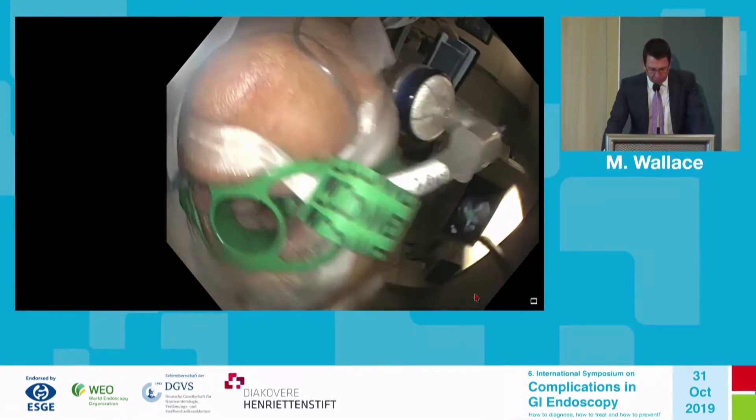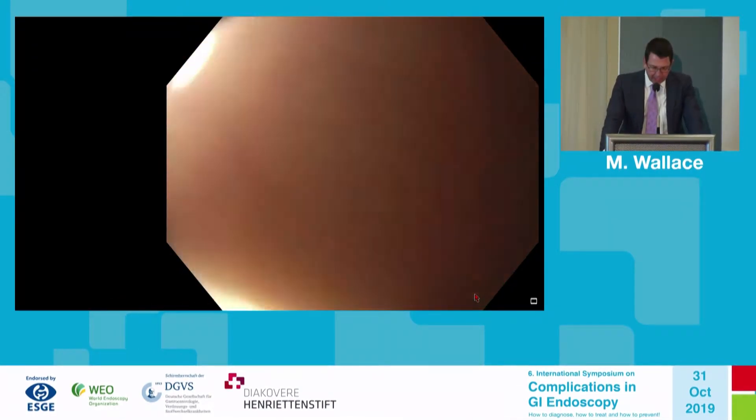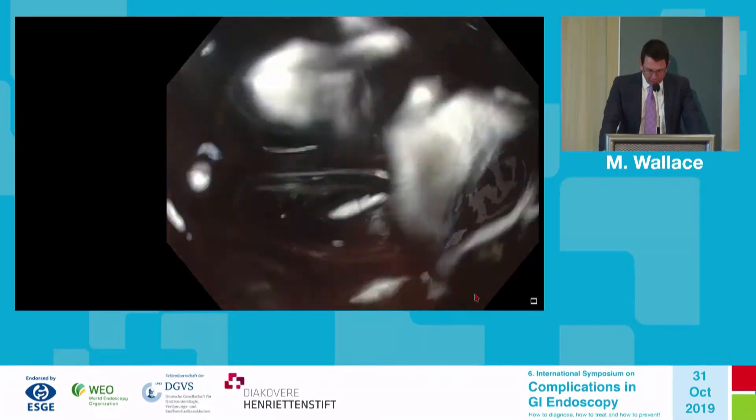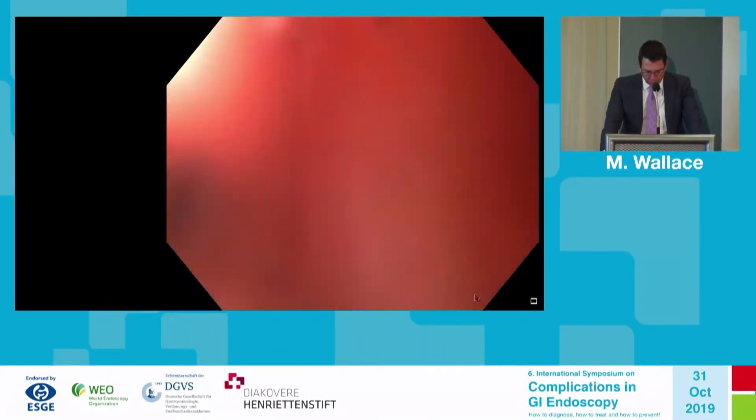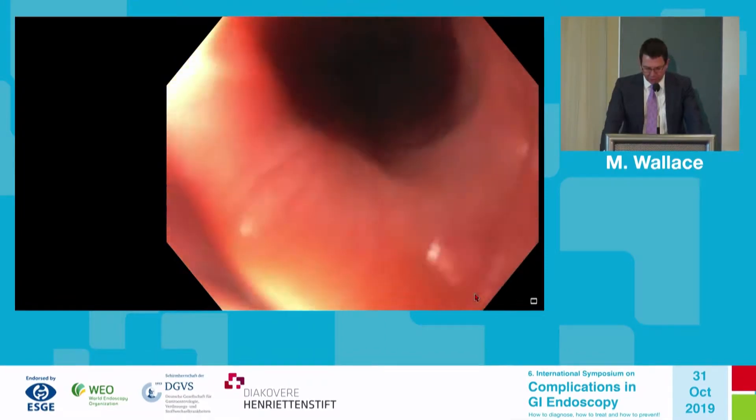You can see the white electrocautery marks around the small nodule in the center. We re-endoscoped the patient, now without the cap on the device. Notice that there is some hemorrhage and some small mucosal tears, particularly in the upper sphincter.